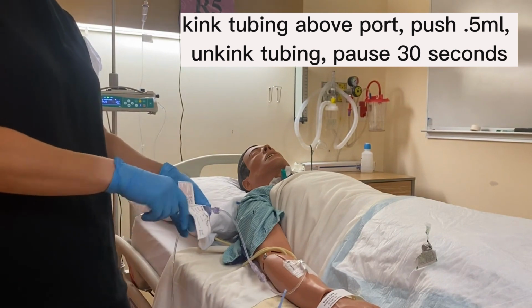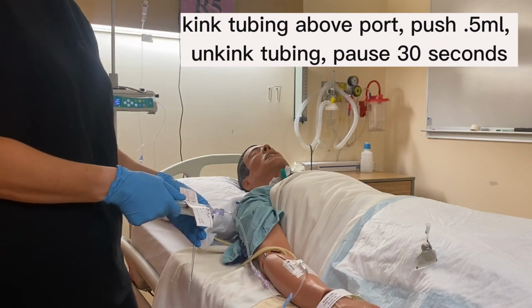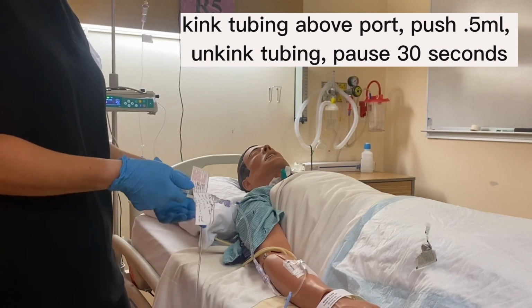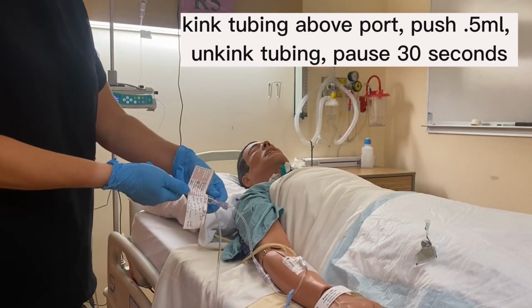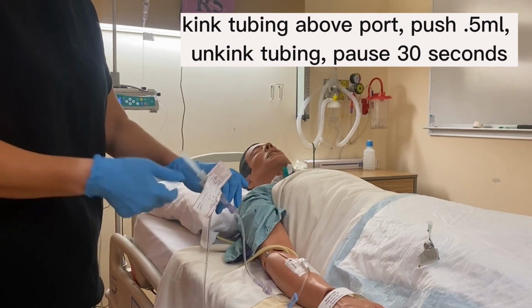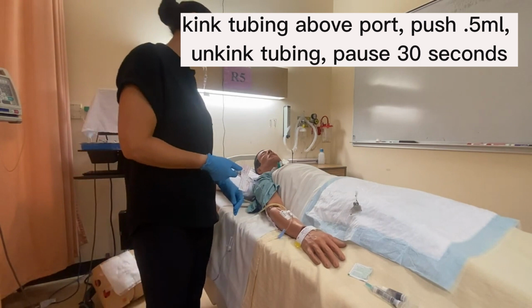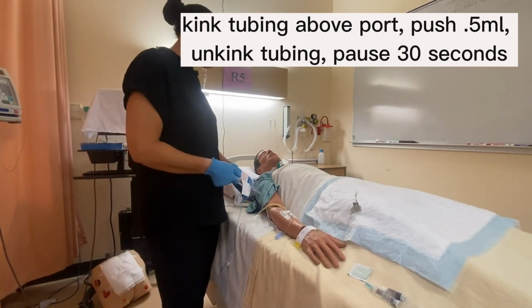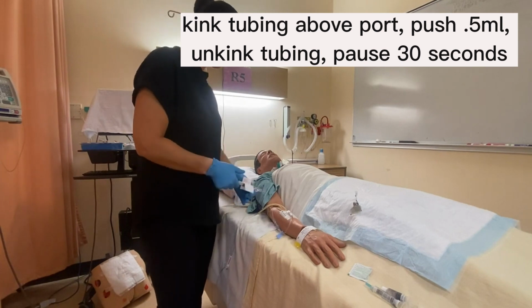Okay, so if I've got a watch on or I can see the clock on the wall, I'm going to watch for 30 seconds. Now, kinking the tubing, the pump doesn't really notice it if it's kinked for a short period of time, and then we unkink it to let the primary infusion flow. I will often let my patient know as well, and their family, that I might be standing here for a little while because this medication is going to go over 5 minutes.